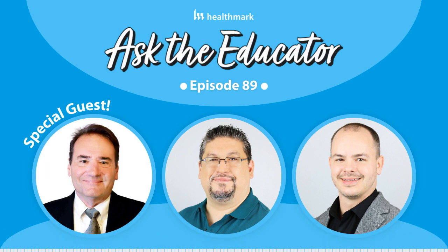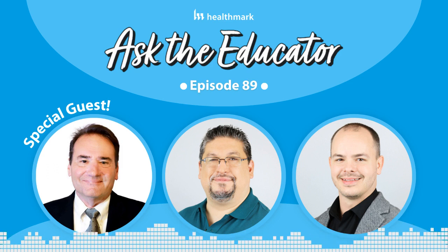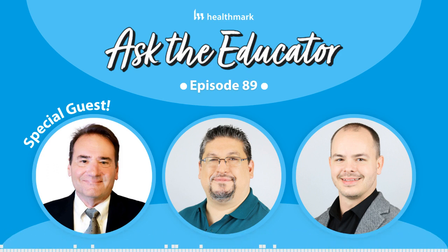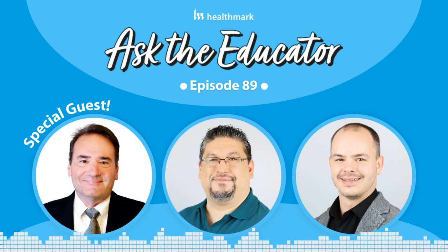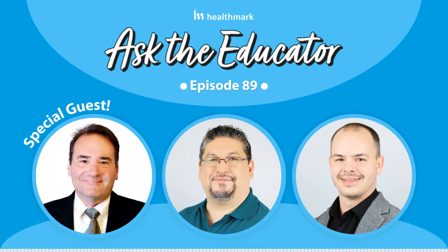Let me tell you, and I know I'm talking to people who are out in the field all the time, I can remember going into a facility and looking at a washer disinfector. We were not even there for that purpose. I was there with your colleague, Steve Kovac, doing in-service on something else. And we're looking at this washer, and there's water shooting out where the spin arm is supposed to be. The spin arm was supposed to be there. Is that worst case? For a device manufacturer, you're not expected to account for that. That might be real world, but that would be an example of misuse.